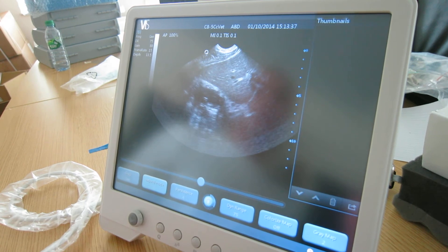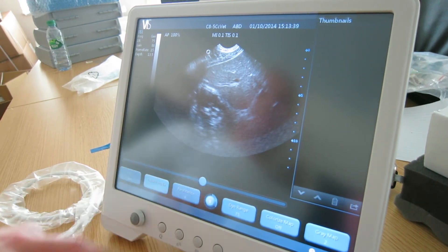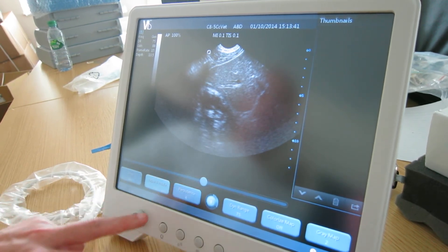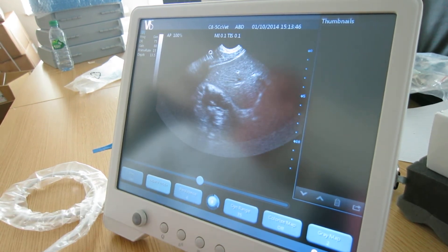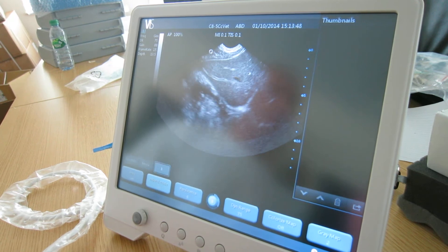Persistence. Depending on requirements, it's better to have persistence probably around the 2-3 mark. Sometimes the 2-4 mark is fine as well.